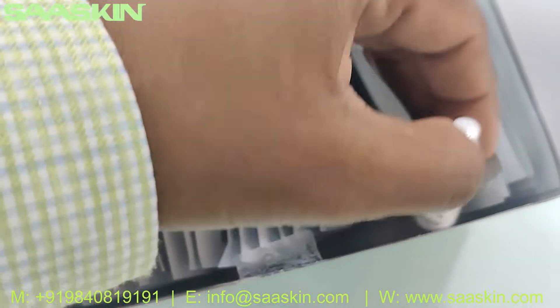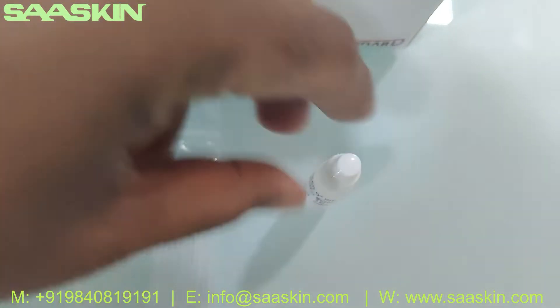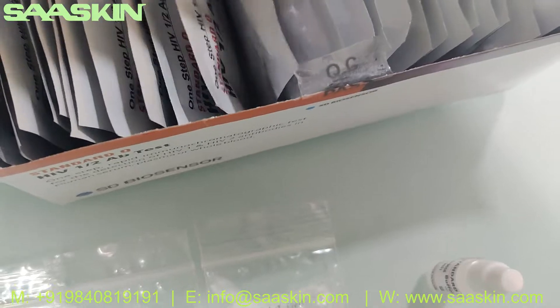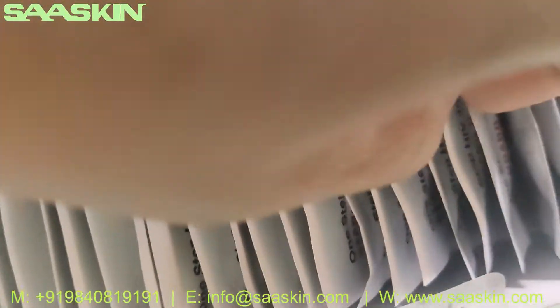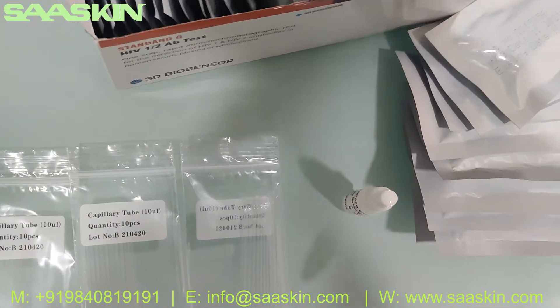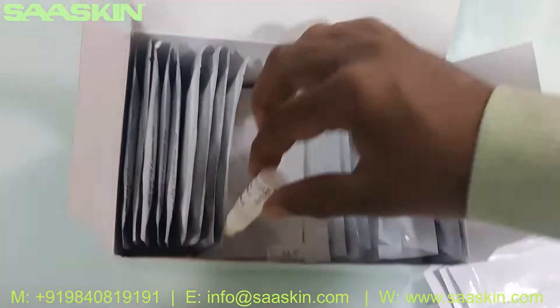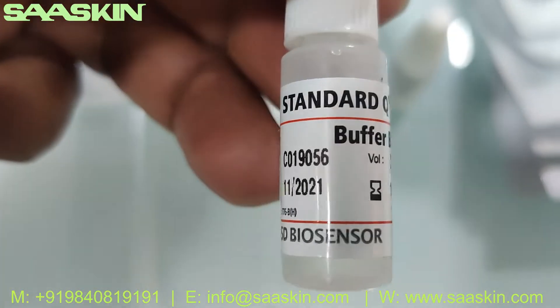We got a buffer bottle here. You can see there is one buffer bottle, which is a 2ml bottle. And you get one more buffer bottle also — so in total you get 2 buffer bottles, each 2ml. You can see the buffer bottles, each 2ml.